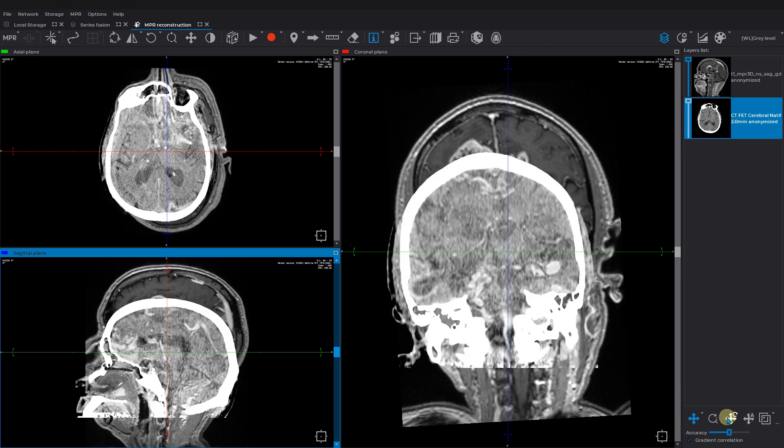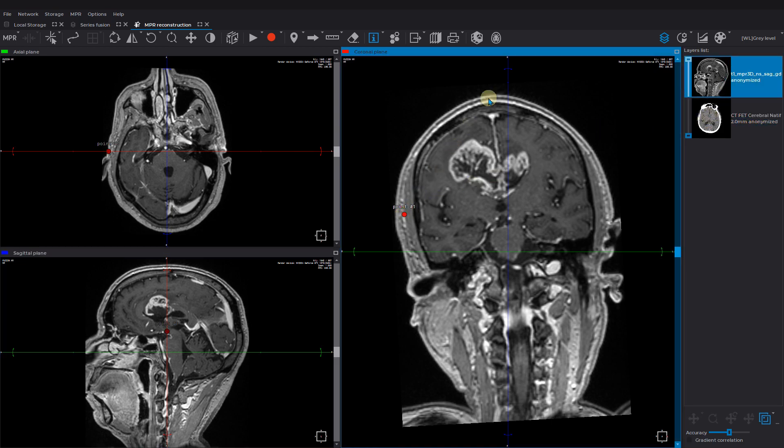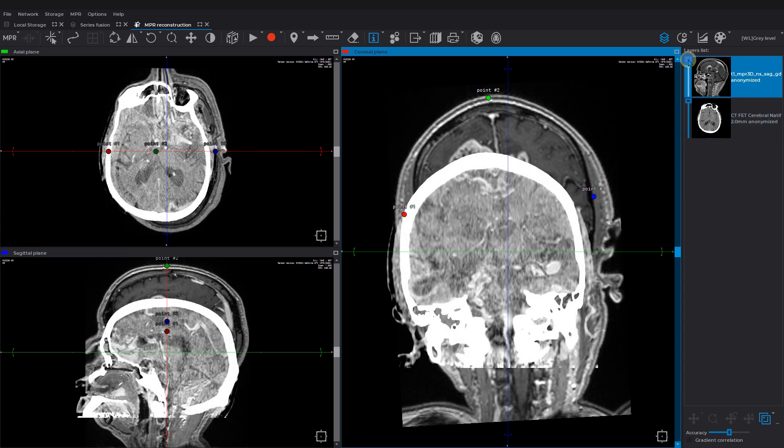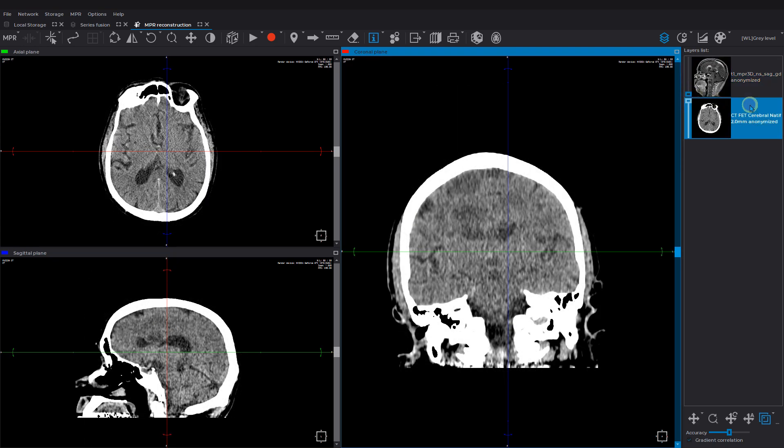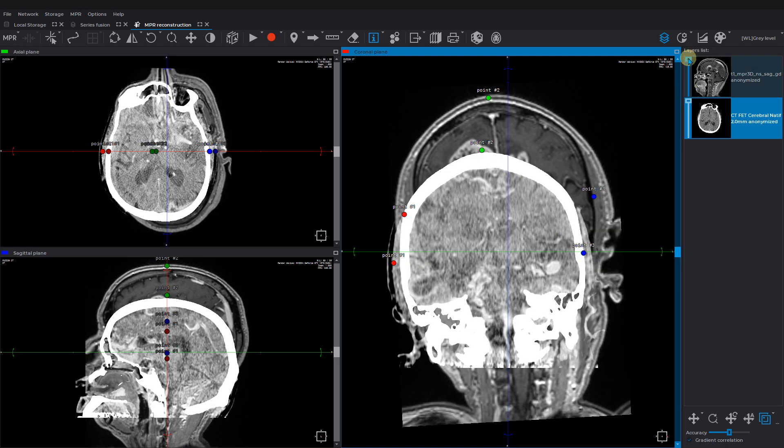If you like to merge the layers by points, activate this function. After that, choose the layer and set several points for merging. Repeat the same sequence for each layer. Now we are making the layer transparent by moving the vertical slider. This helps us to facilitate the marking process. After all points are set, activate fit layers function in the drop-down menu.